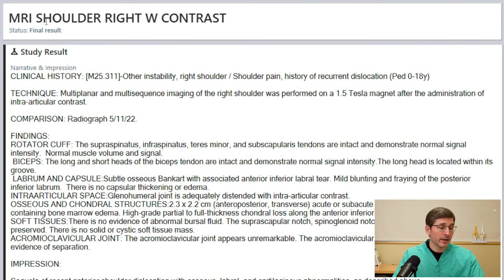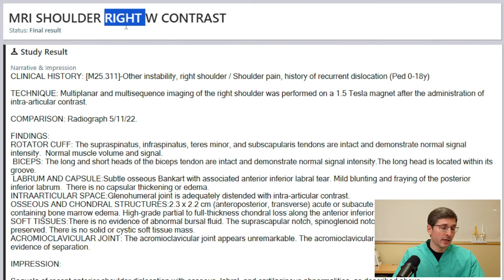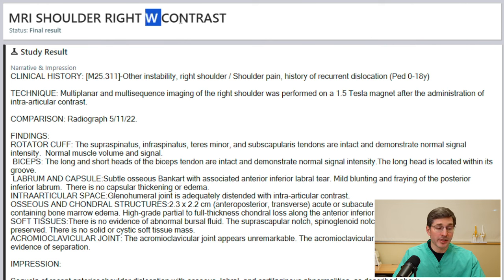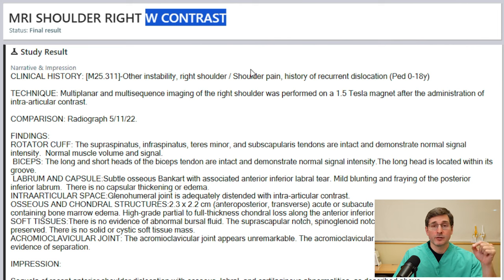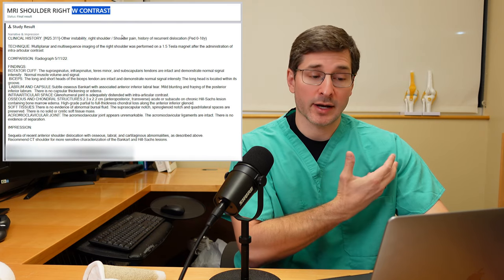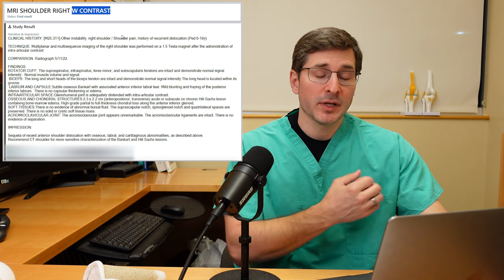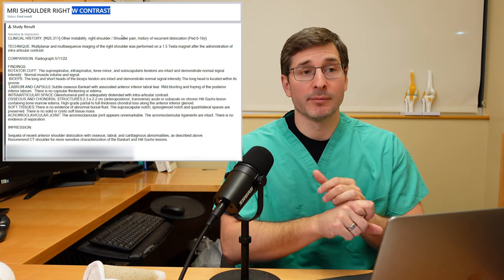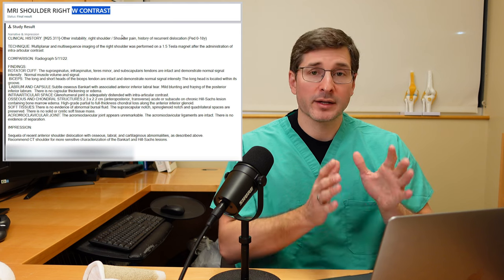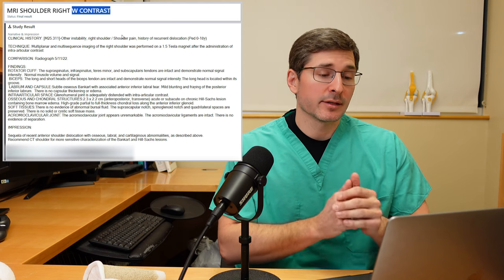We're going to go over case two now. This is also an MRI of the right shoulder, but this one says 'W' for 'with' — it's with contrast. This is referred to as an arthrogram, meaning prior to the MRI the radiologist put a needle inside the shoulder joint and filled it with contrast, which is gadolinium. That contrast diffuses through the joint and makes it easier to see certain structures like the labrum. In the right clinical situation it's often helpful to add that.